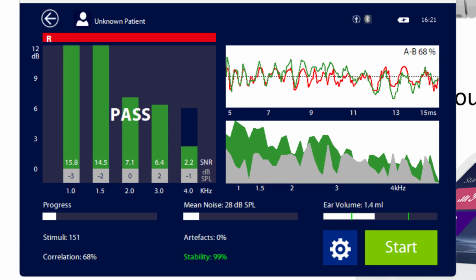the OAE. And if you look very carefully, you can see that the wave pattern in the beginning is faster, so that's high frequencies, and then the wave pattern in the end is more slow, means it's the low frequencies coming out last. Fine. I'll explain that a little bit in more detail in a little while.